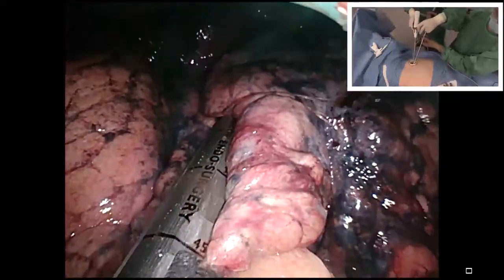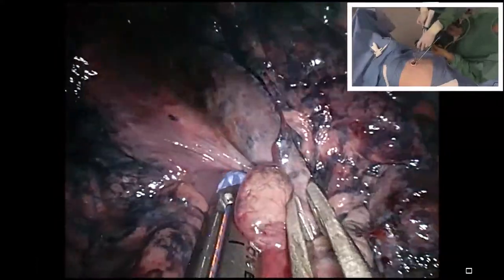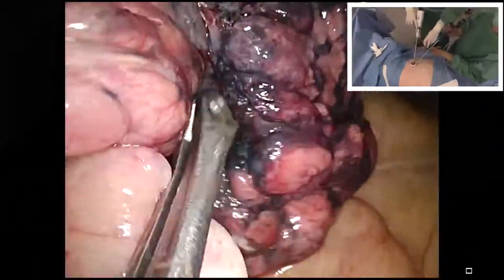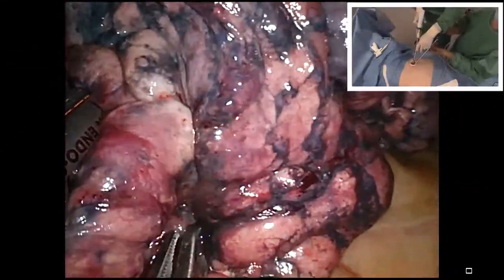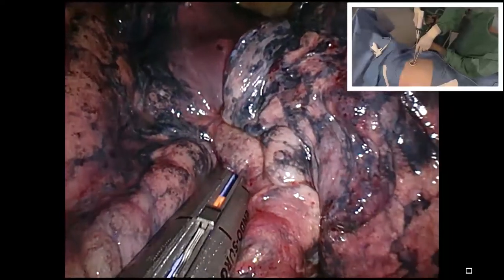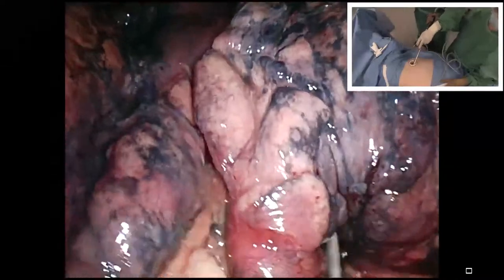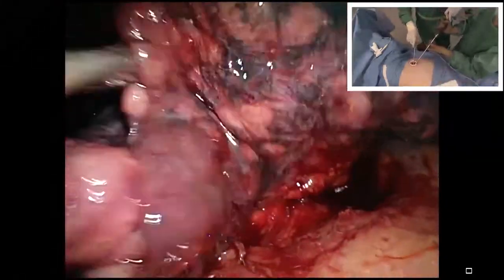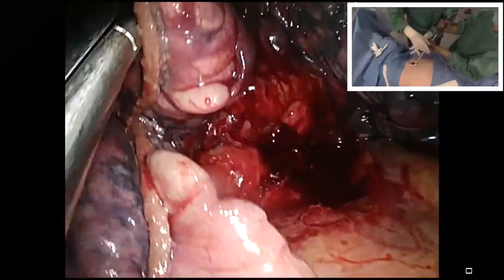So the first shot must be along over here because it's 45. Show me here. We are okay. Next. One more. You can already put three blue ones on the table. Suction. Clean.